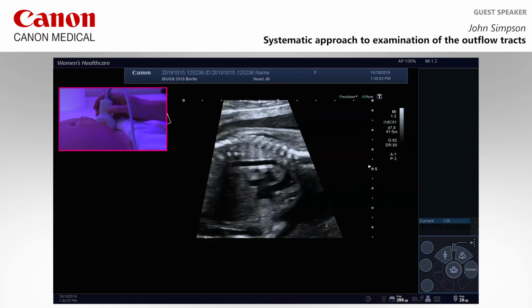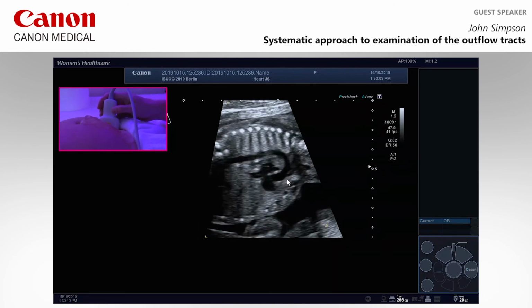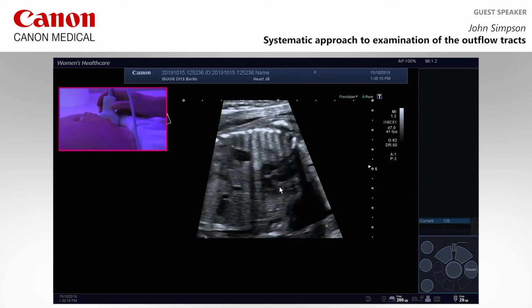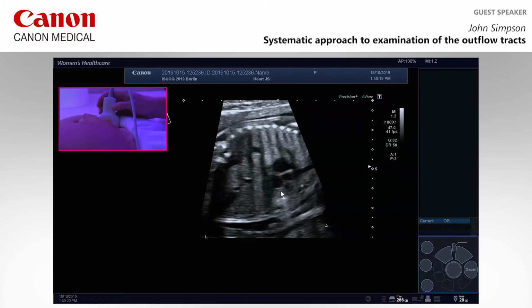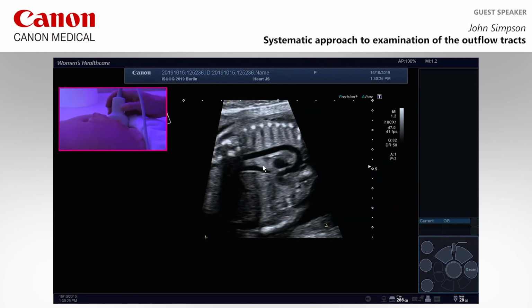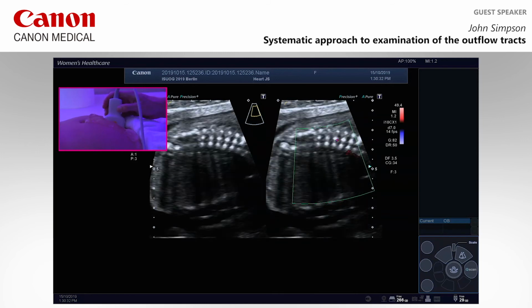So again, there are normal ranges for both the aortic arch and for the ductal arch. So I'm switching here from the tightly wound aortic arch with the head and neck vessels, where you see the RVOT and the beginning of the PA arising much more anteriorly in here. So you've got the aortic arch here confirmed with color.